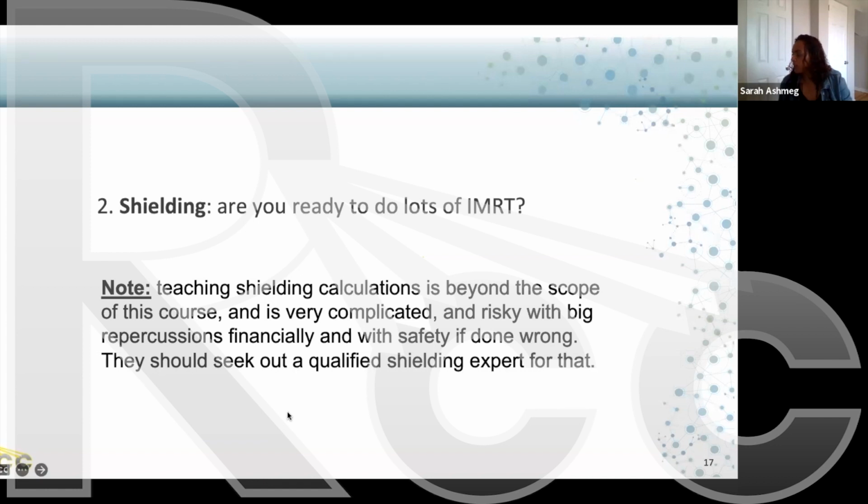Okay, Kevin Mahdi has a question. Why do we use an odd number of fields when we plan IMRT? So at our clinic, we don't necessarily use an odd number of fields. We don't set any limitations towards even or odd. I'm not sure why there would be a need to use an odd number of IMRT fields.